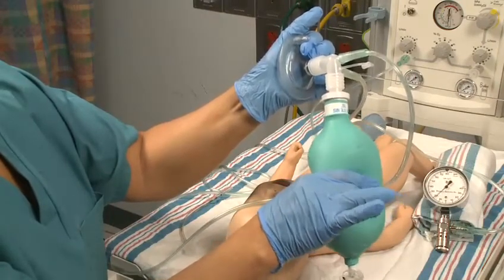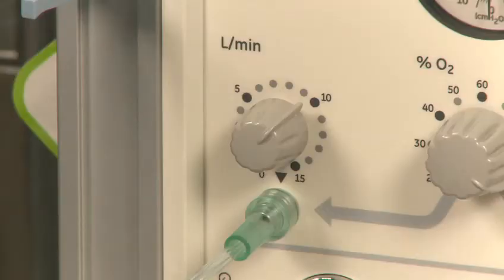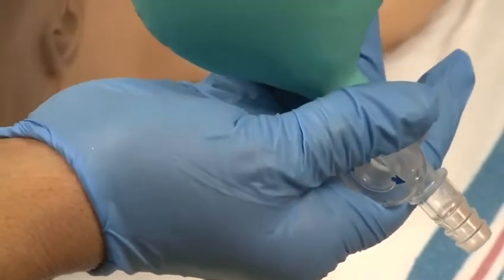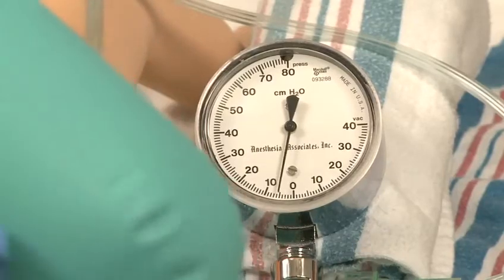First, adjust the PEEP or end expiratory pressure. The flow is 10 liters per minute. The bag is fully inflated. Adjust the flow control valve to achieve the desired PEEP, which is usually 2 to 5 centimeters H2O.